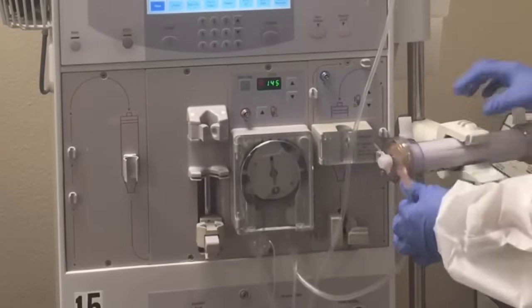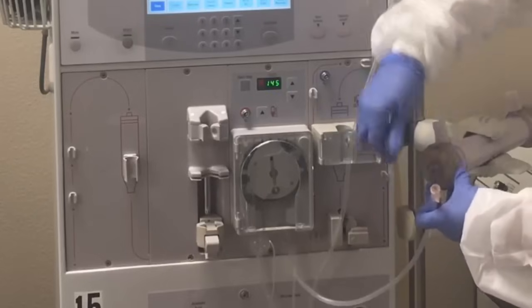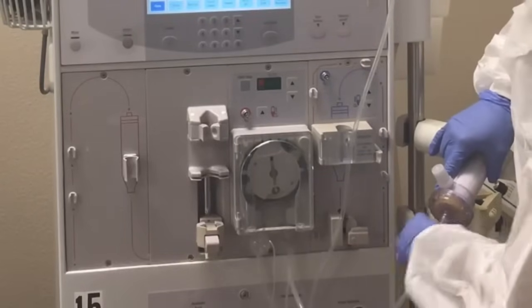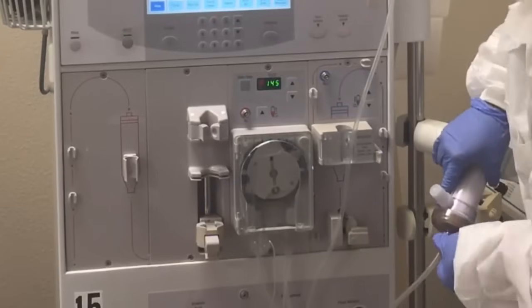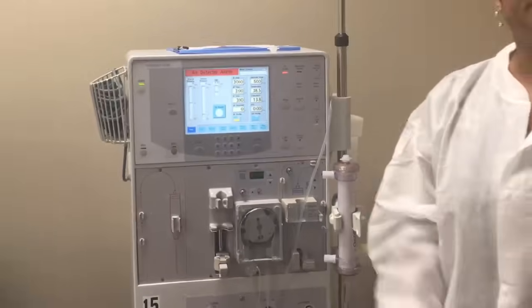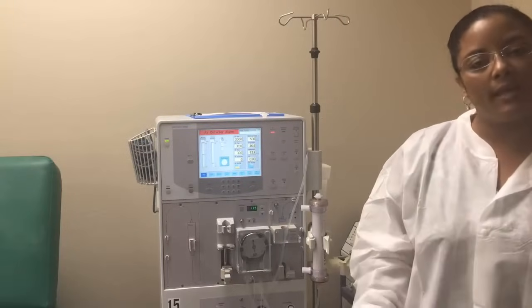This tip you're going to connect to the bottom of your filter. There you have it — you have your first line, the arterial line.